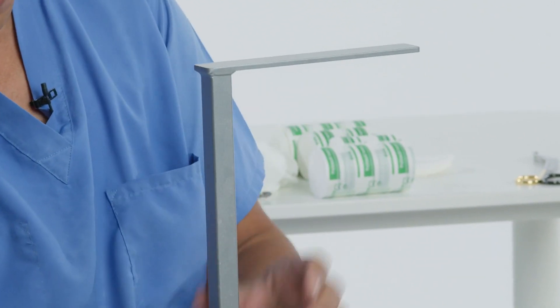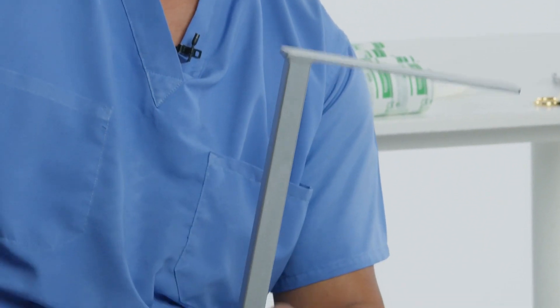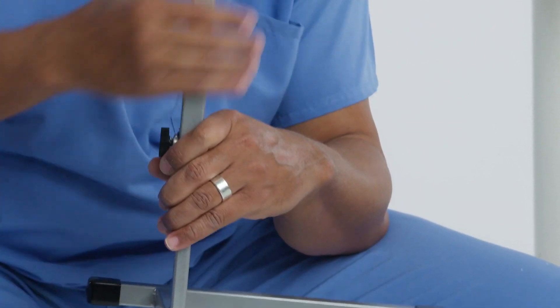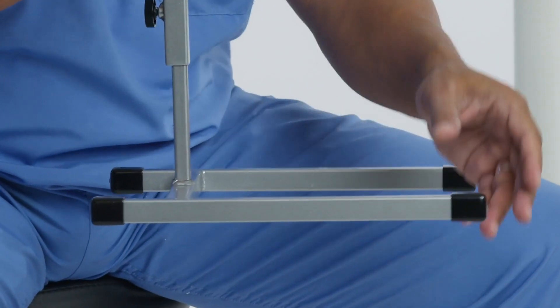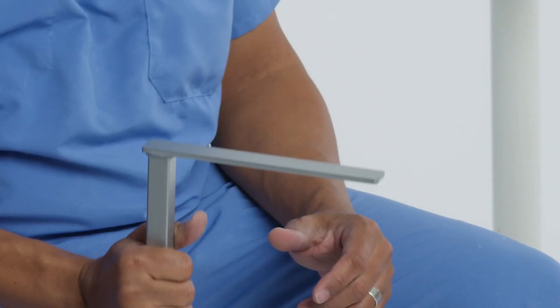This needs to be cleaned off and there's a little dial to tighten the height. Every now and then you may have some of these in your clinic where they're off center, meaning they rock a little bit. So you have to maintain your foot on this once you get the patient in position, because any movement or jerk is going to be very painful for the patient.